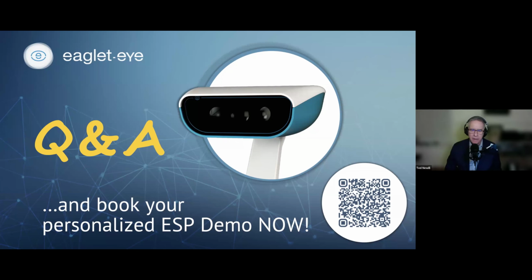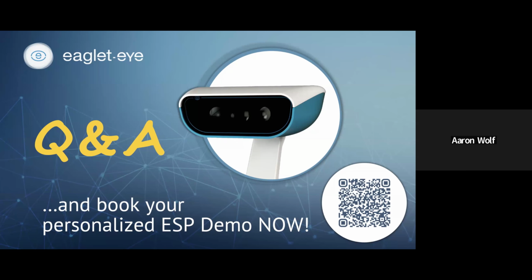That's good. And then somebody asks, I've had some fitters say you should really master one design of scleral and only go to others if need be. Are those with the ESP finding they can master multiple designs more easily? Yeah, I'll just keep jumping in, Ted, until Sheila or anybody else has an opinion. But to me, I feel differently. I like using different labs for different reasons, and it can be from how customized I want the lens to be. Do I want it to be software based or not?